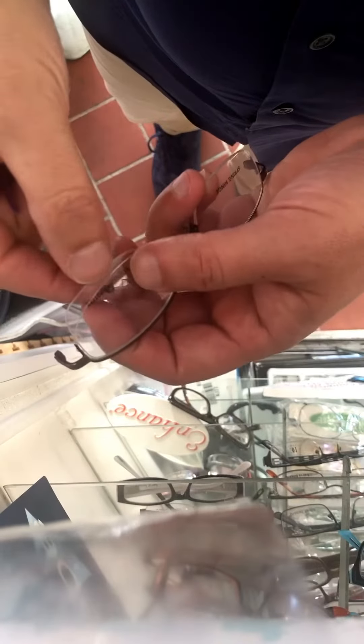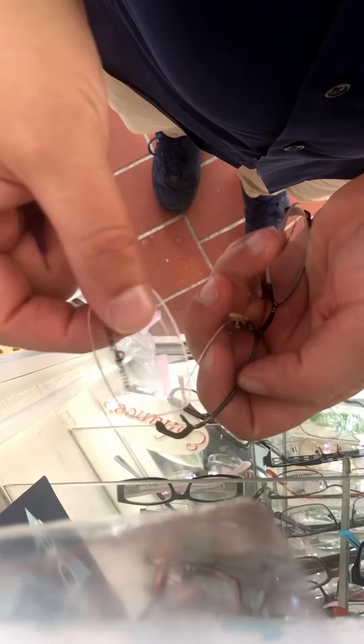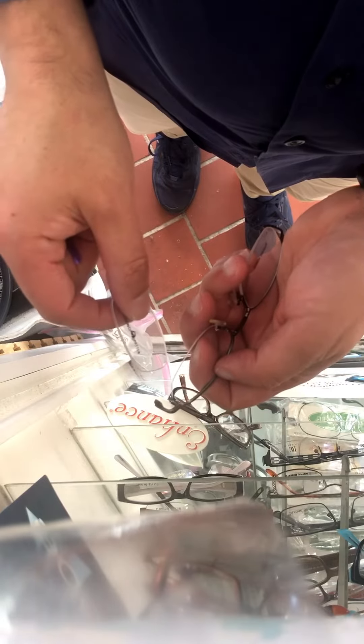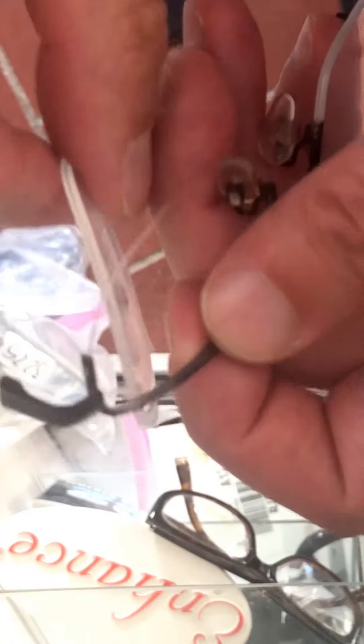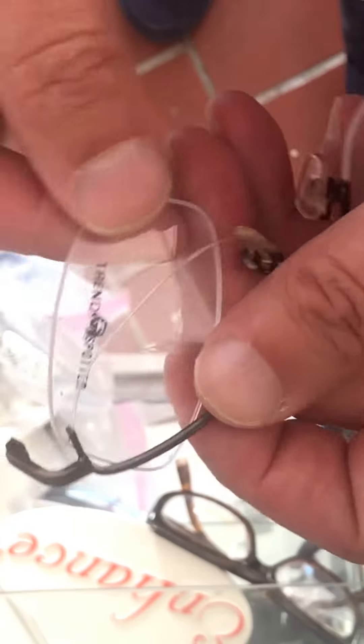Did your lens pop out of your half-rim frame? This is a half-rim wired frame — the top is metal and the bottom has a wire. Sometimes these lenses pop out. I've got a quick fix for you, don't panic. Let me remind you, it is better to bring it to an optician, especially if you have an expensive lens, but if you just can't get to one and you really need to take care of this, here's how you do it.